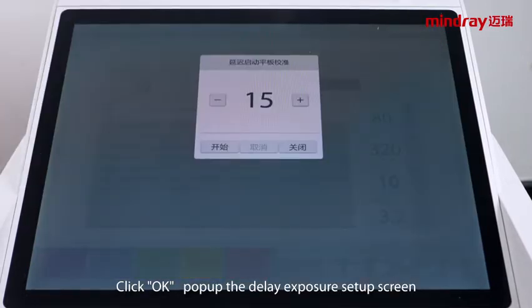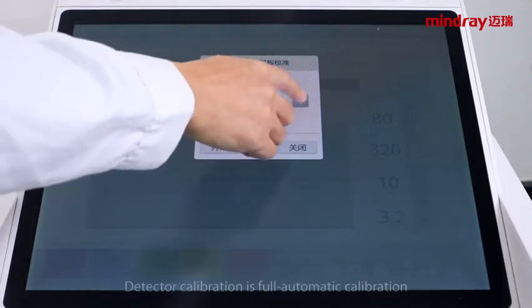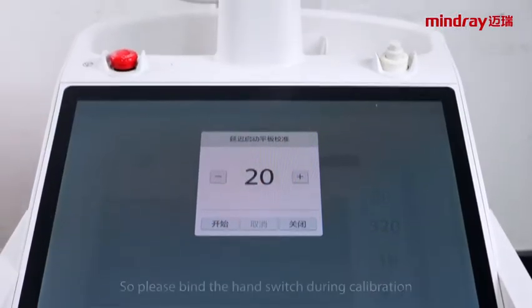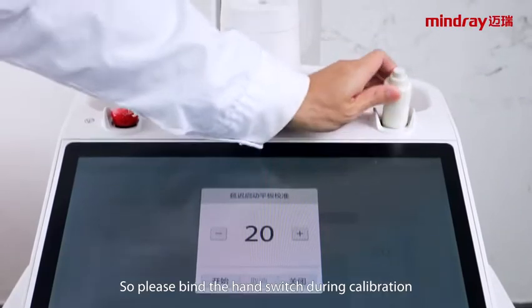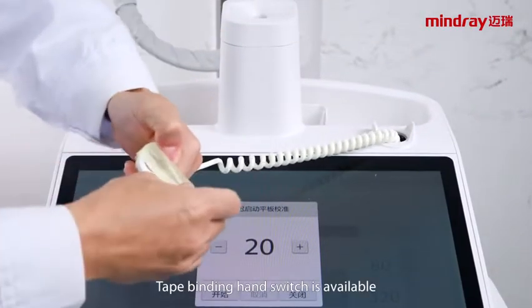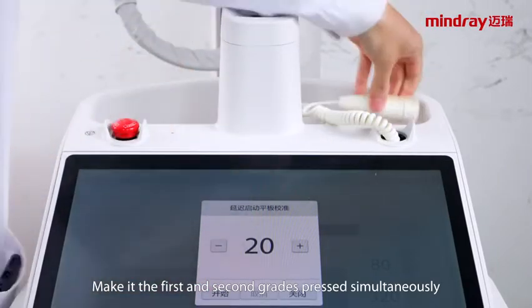The delayed exposure setup screen appears. Please set up enough time for the operator to leave the shooting room safely. Detector calibration is fully automatic calibration, so please bind the hand switch during calibration — taped binding of the hand switch is acceptable. Make the first and second press buttons pressed simultaneously.